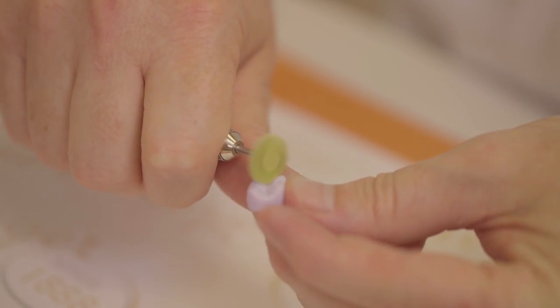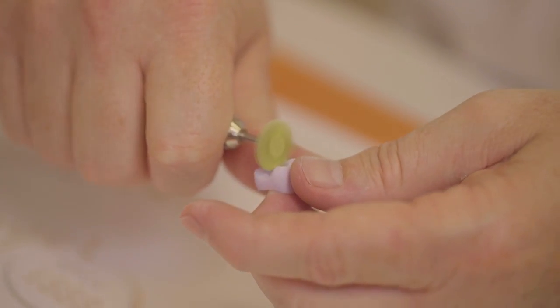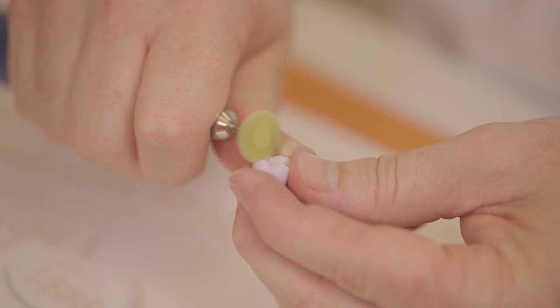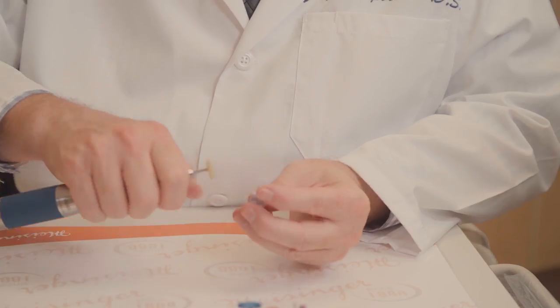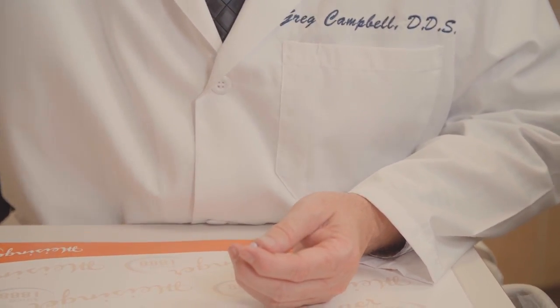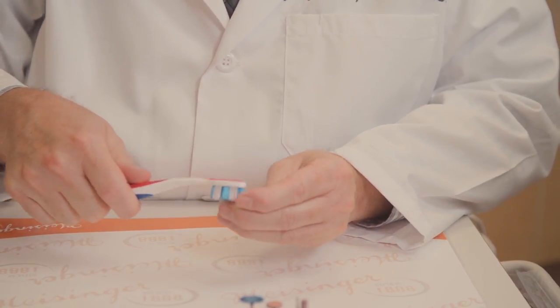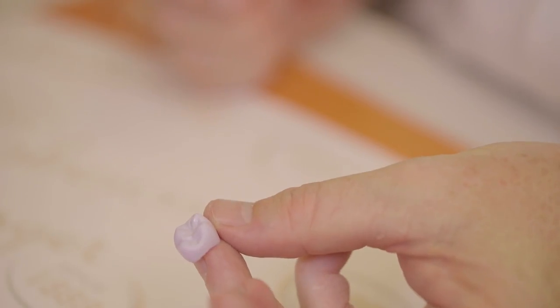Now I'm going to go in occlusal. I've got some great anatomy on this restoration. I'm going to walk this through the grooves. Light pressure. You can try medium and then go to light, and you'll see that light does everything you need it to do for you on here. I'm going to clean this off. Got a lot of dust on here from polishing, and you have a very highly polished restoration.